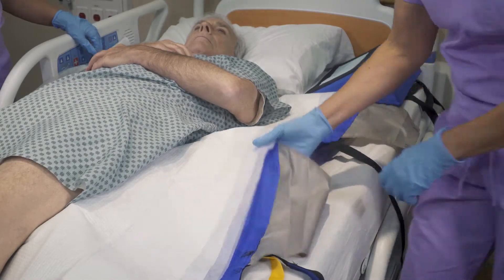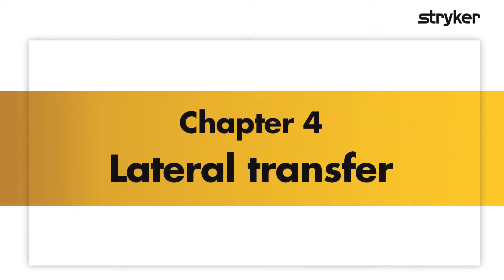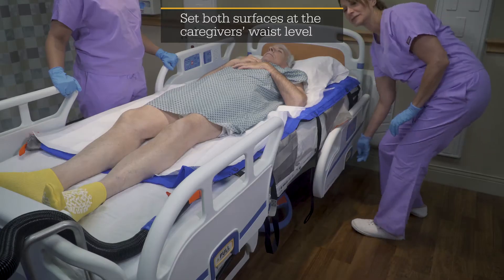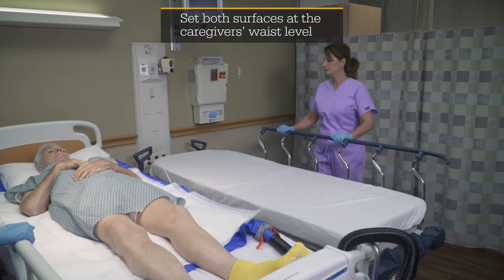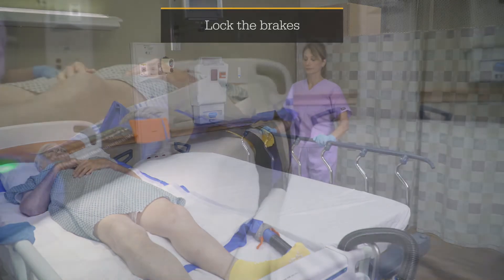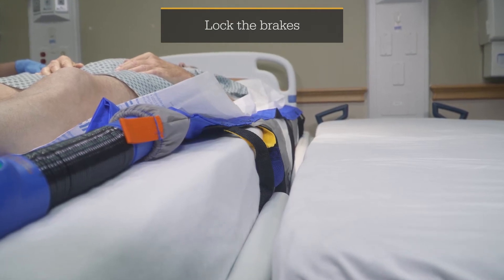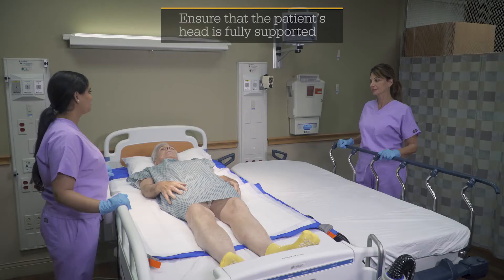Remember to remove the wedges prior to boosting or transferring patients. To perform a lateral transfer, lower the rails between the transfer surfaces and move the surfaces as close together as possible. Set the sending surface no more than one inch above the height of the receiving surface. Raise the exterior rails with a health care provider on each side.